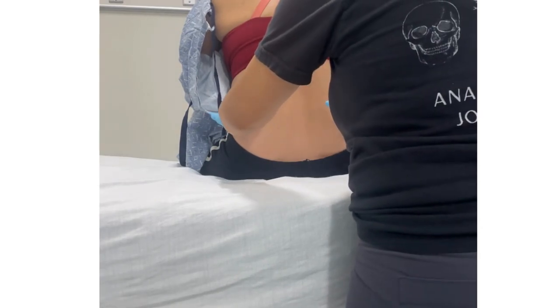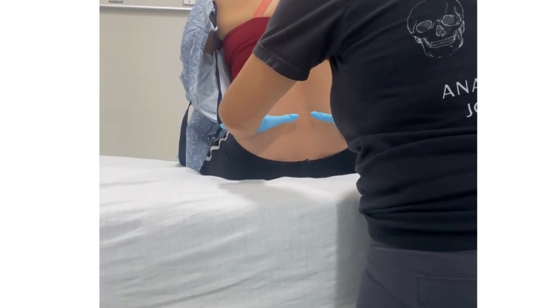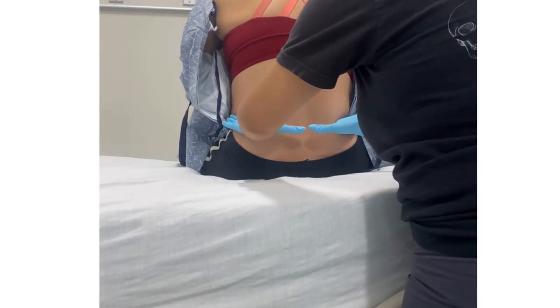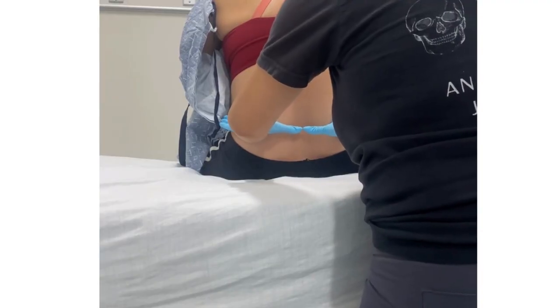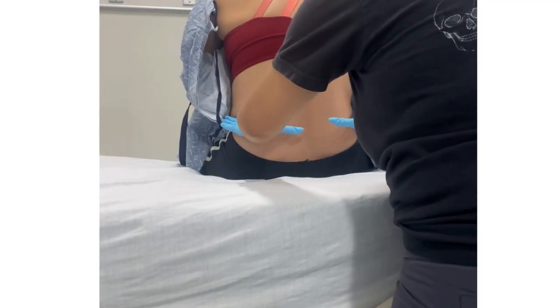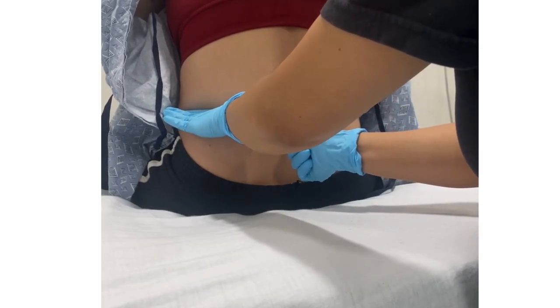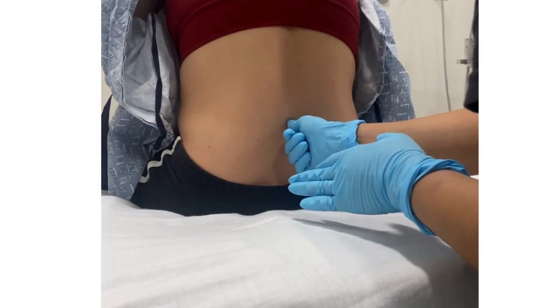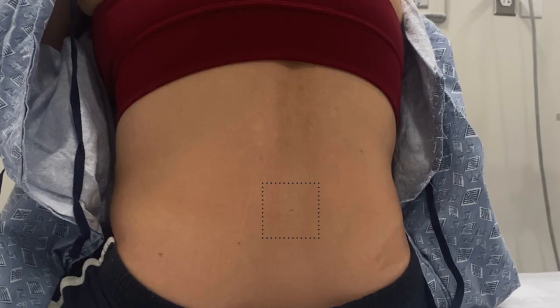Start by locating the top of the iliac crests bilaterally and bringing your thumbs together to form a transverse line, commonly referred to as Tuffier's line, which approximates the level of the L4 vertebral body. Palpate the area thoroughly to identify the spinous processes and determine the midline. Once you have confirmed your landmarks, mark the site of intended needle insertion. You can use a marker, the tip of the needle cap, or your thumbnail to mark the site. Here, I used my thumbnail to mark the site.